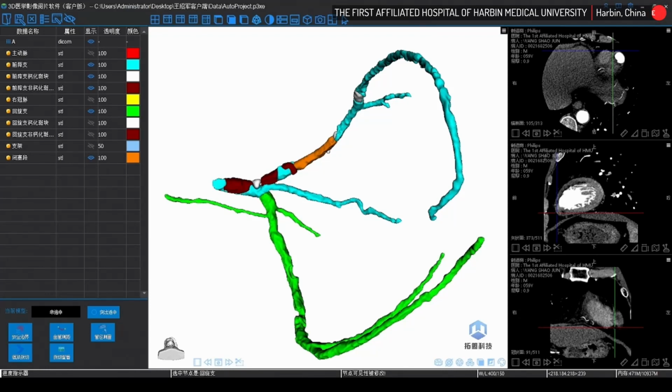And also we can see the plaque composition is, I think, majority fibrotic from this composition, with a mild calcification at the ostium of the LAD. We also know that this kind of CTO with a bifurcation is at very high risk of failure from the antegrade approach because there are some patent side branches.